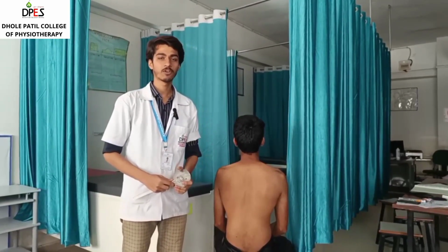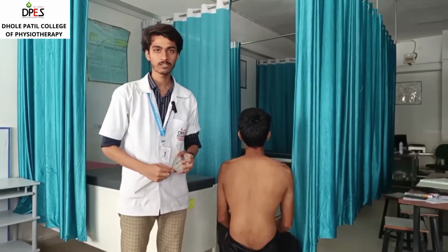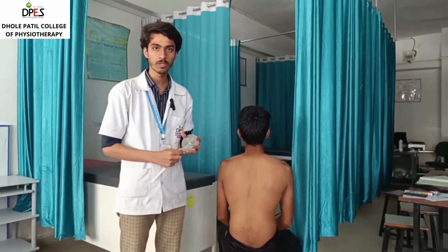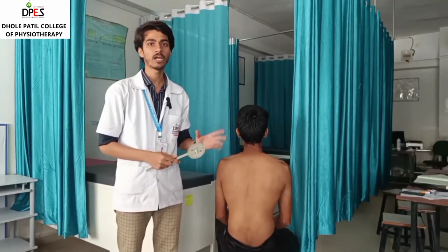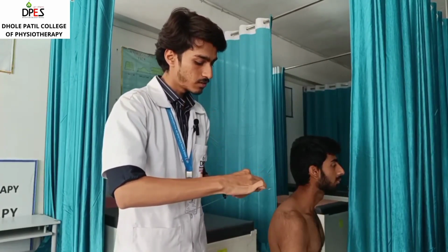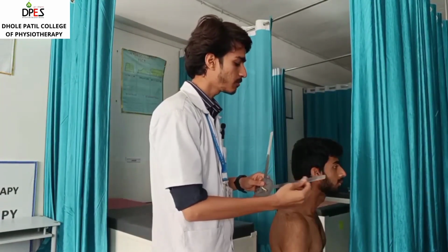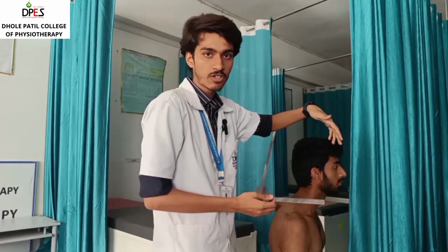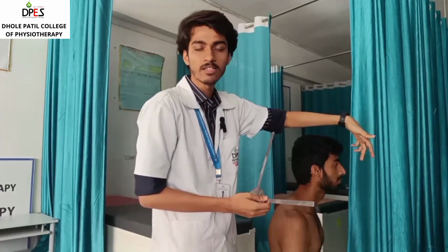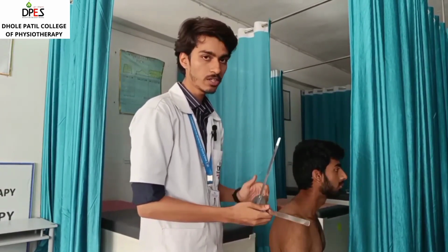So now we are going to perform goniometry for cervical region. There are basically 7 cervical vertebrae, but the flexion and extension movement of the neck is performed in the atlanto-occipital joint. So now we are going to perform flexion movement of the neck. For that, the fulcrum of the goniometer will be the external auditory meatus. The proximal arm should be the imaginary line joining the external auditory meatus and the tip of the nose. The distal arm will be perpendicular to the ground.